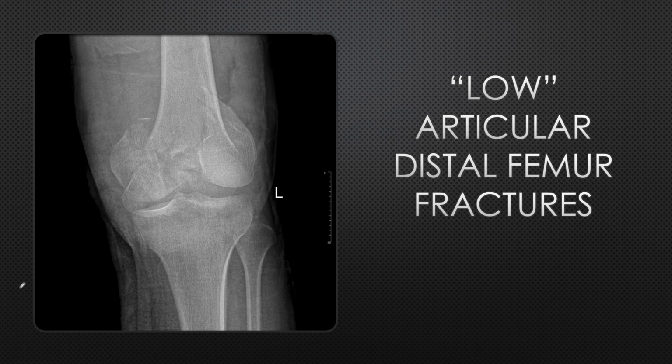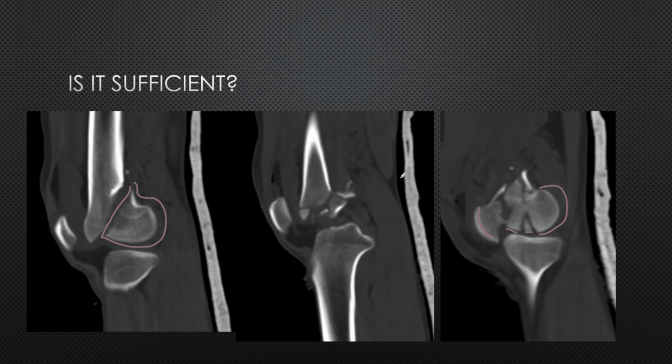And as we go towards the medial side, first in the notch part, here we have extensive comminution in the notch. And as we go more medially, we see there are multiple split fragments, like you see here, one large fragment here, another small fragment here, another small fragment here, and another large fragment posteriorly. And definitely comminution is there on the articular side as well as the extra-articular side. So these were the sagittal cuts.